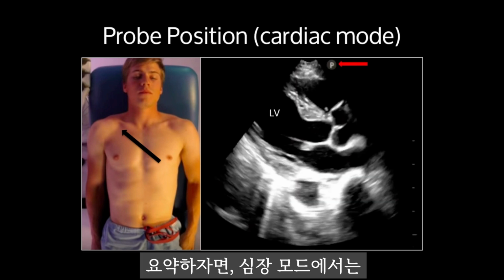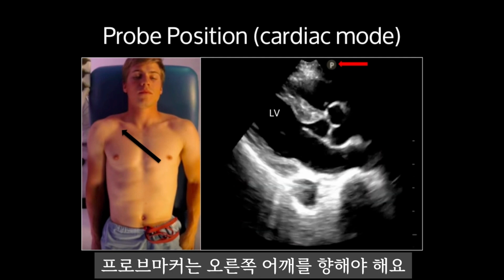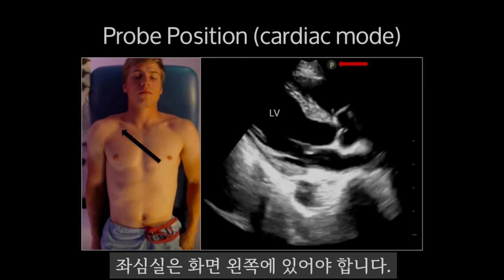So, to summarize, in cardiac mode, the indicator on the screen should be on the right side, and the probe marker should be facing the right shoulder. The LV should be on the left of the screen.